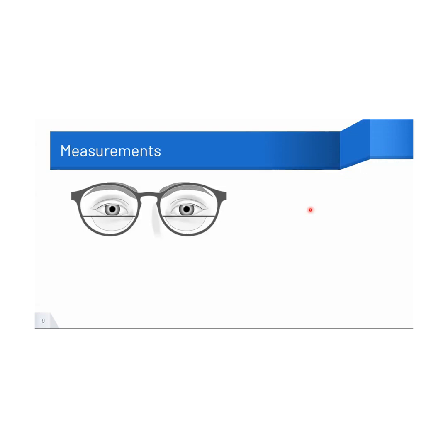Okay, for kids, lower pupil margin. Thanks, Maria, for that. I'll wait for more responses. Lower pupil margin. Great. Okay. Go on. And this is for everybody.